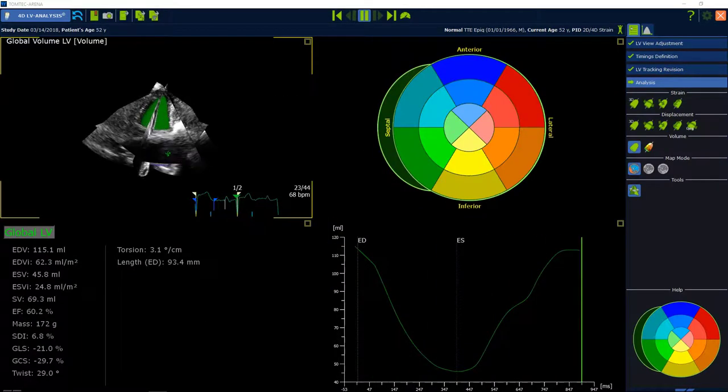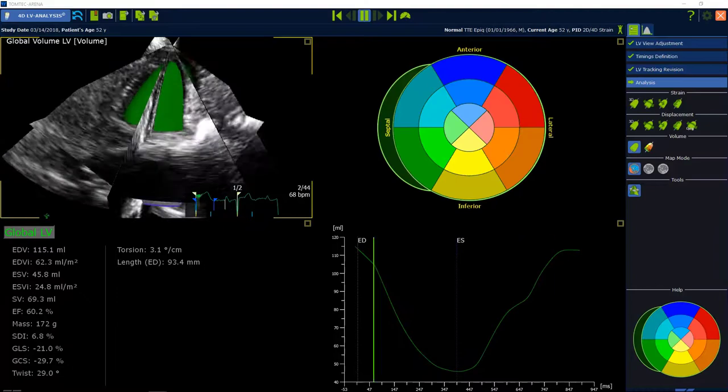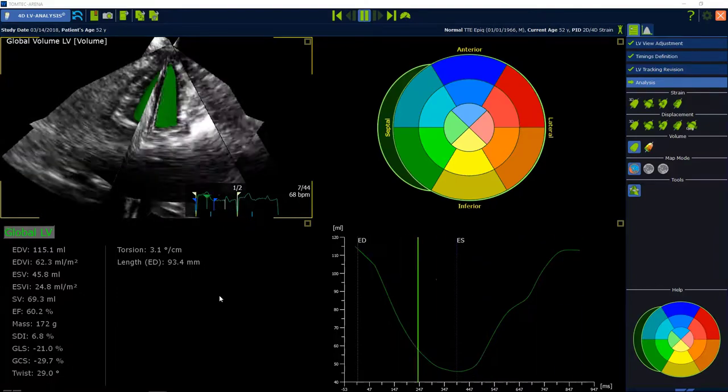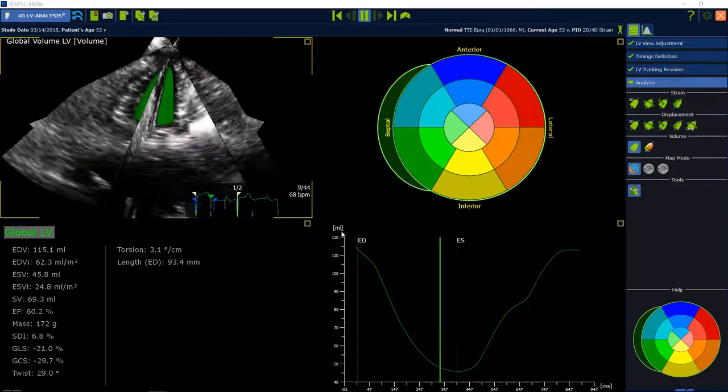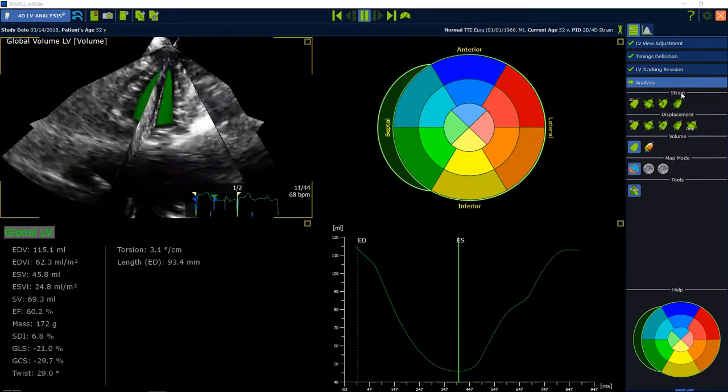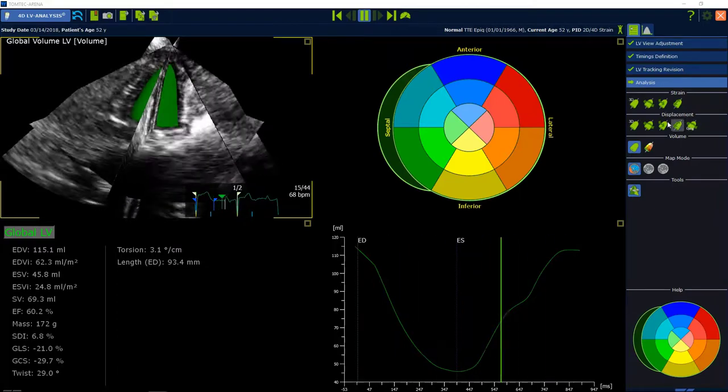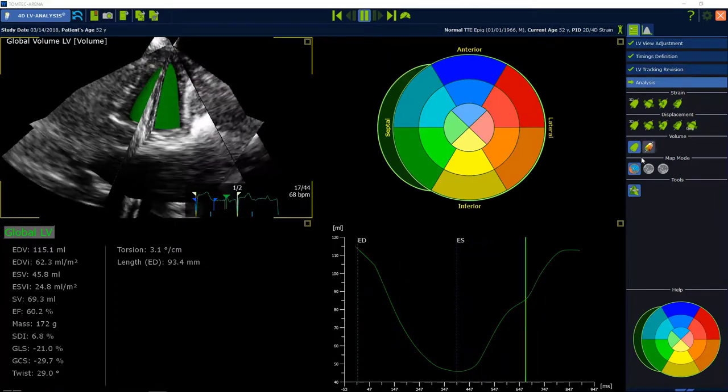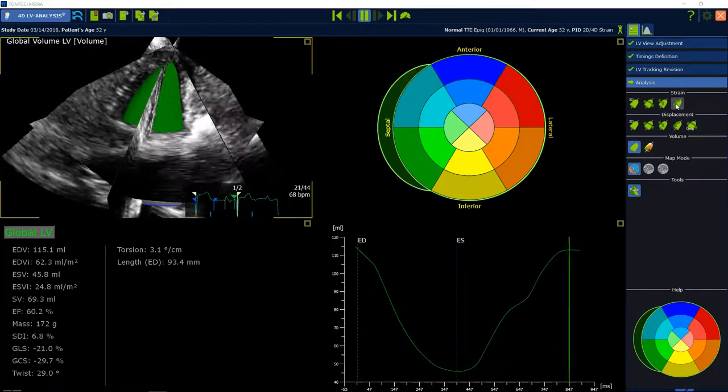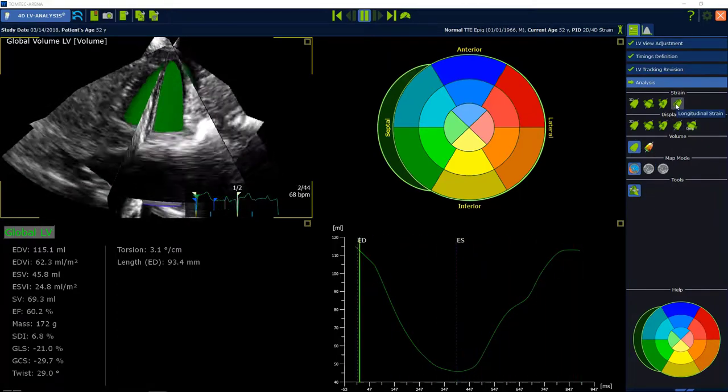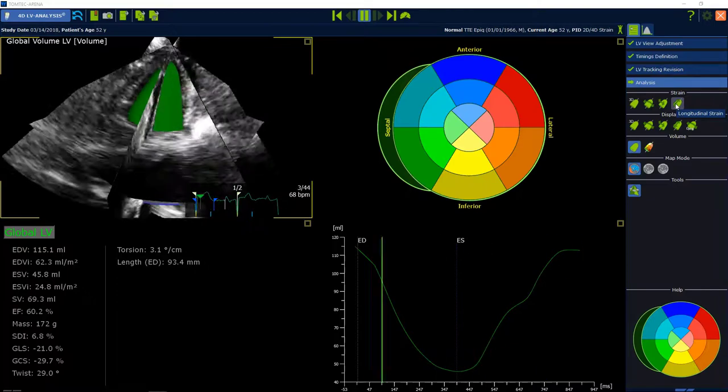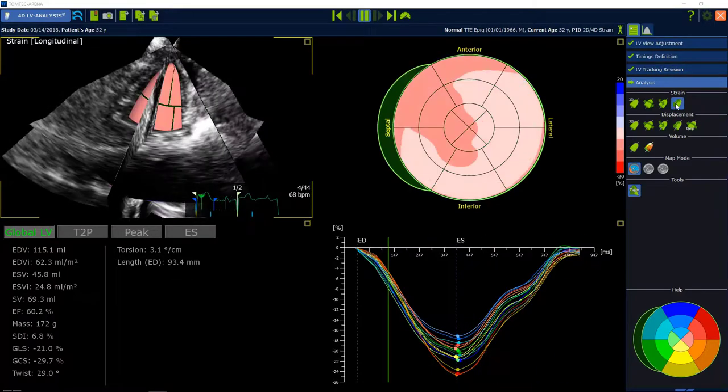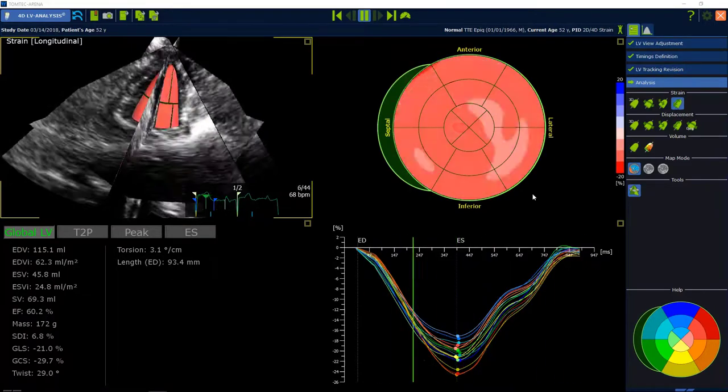On the left side you can see the global values. On the right side various display options are available. Strain displacement and volume values can be displayed by selecting the desired options. Let's make one example for global longitudinal strain.